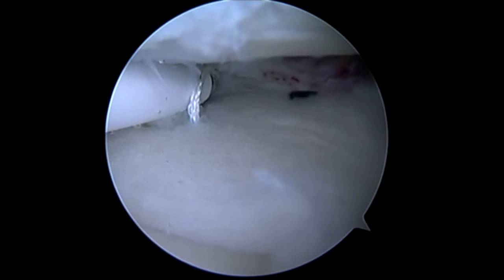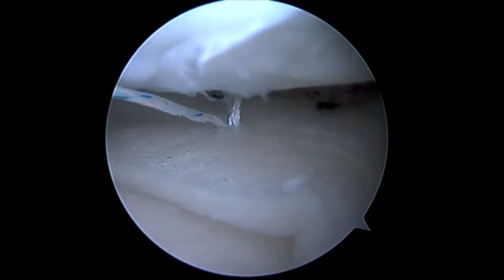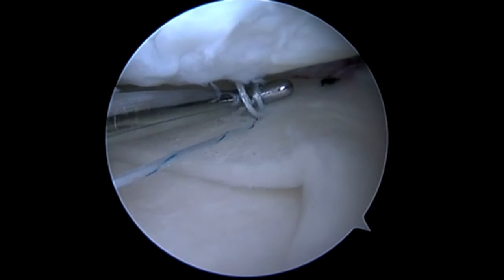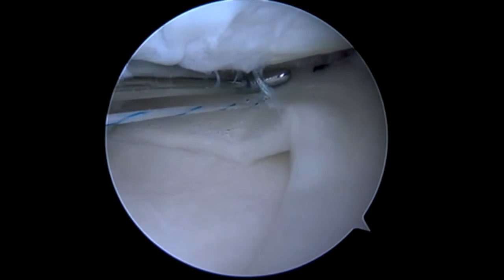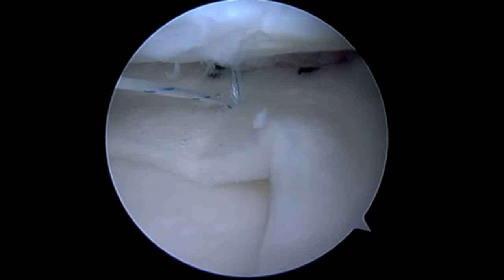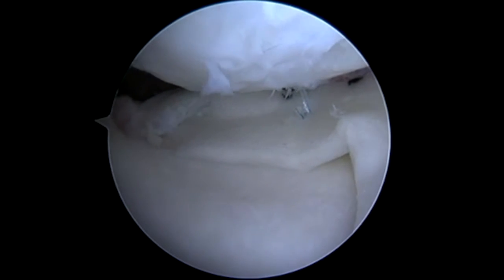This tissue is very, very friable — you have to be careful when you're placing it. Once you've placed your two sides of your implant, you want to bring your probe in and allow the probe to provide the counter traction for the suture to slide around. Otherwise, when you're pulling tension on your device, you'll cut right through your meniscal implant. Once you've got it under tension, we're just trying to approximate — we're not trying to strangulate. We'll move back over to the posterior horn.